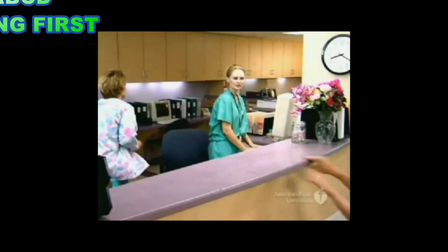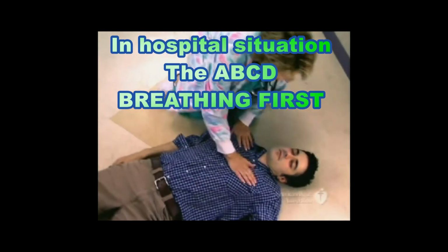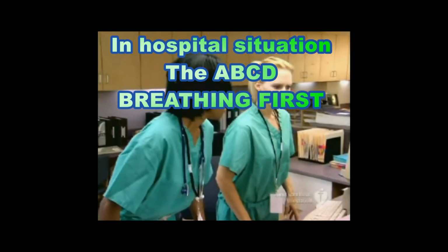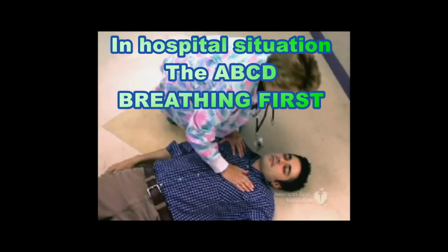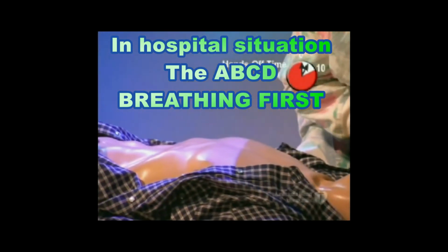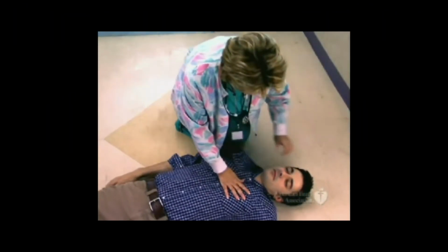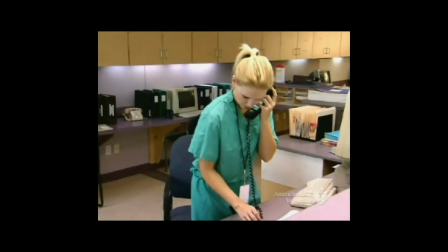If you think someone has suffered a cardiac arrest, first, check for response. Mr. Garner. Mr. Garner, can you hear me? If the victim does not respond, one rescuer should activate the emergency response system and get the AED. While another rescuer goes to activate the emergency response system and get the AED, continue to check for a pulse.